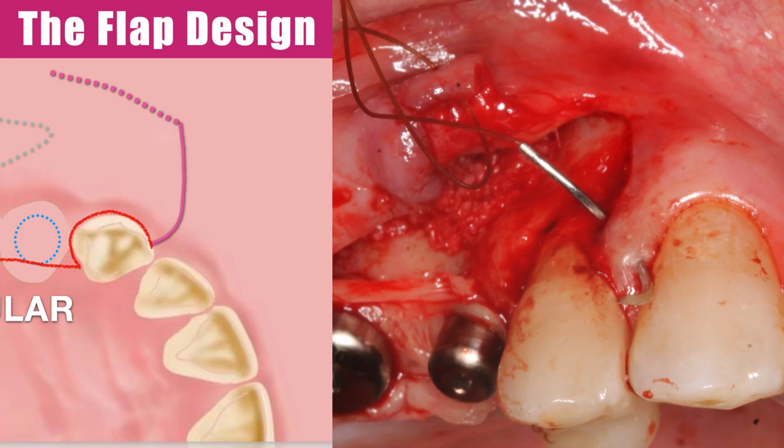Remember the flap design? We left that papilla shape between the canine and the bicuspid, and that portion was never raised. So that's firmly attached healthy tissue. And notice how that good amount of volume does help, because when a suture punctures right through, we do want considerable amount of stable, lean meat, so to speak, to get good anchorage. So this is a good example of a nice flap design that works to our advantage.